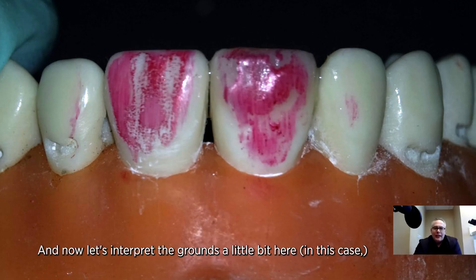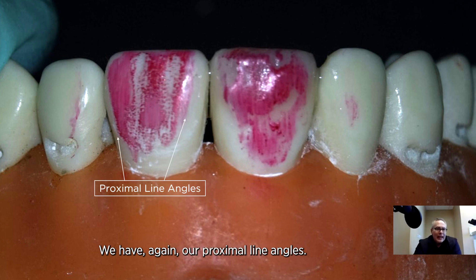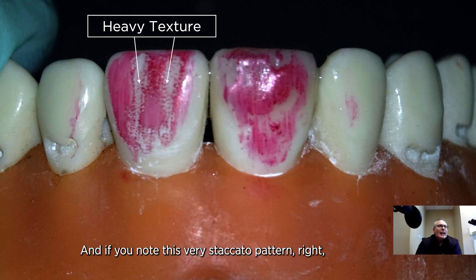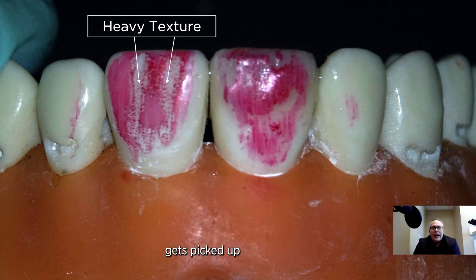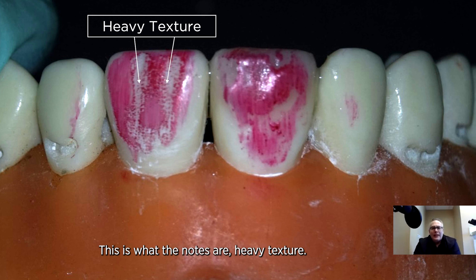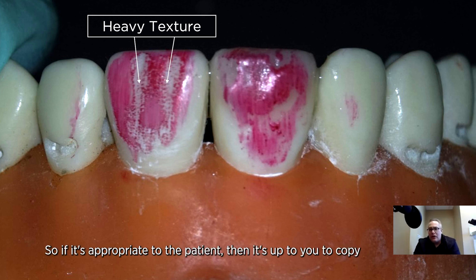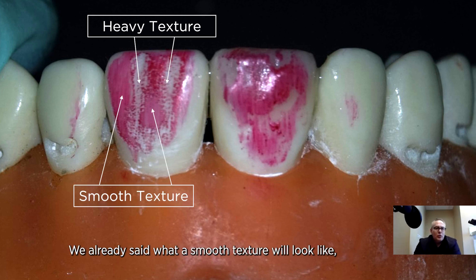Now let's interpret the marks a little bit. If we look at tooth number nine here, which has been modified to look more like a natural tooth, we have our proximal line angles. If you note this very staccato pattern, you can see how that rougher, more pronounced texture gets picked up as very strong horizontal lines — and you'll see that much more easily. This is what denotes a heavy texture. So if it's appropriate to the patient, it's up to you to copy this more heavy or pronounced texture. We already said what a smooth texture looks like — that very uniform appearance.